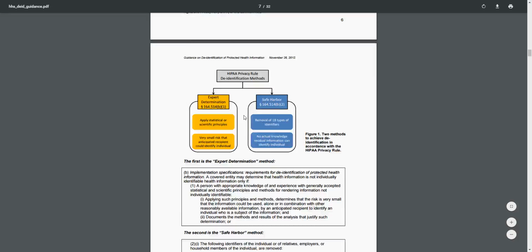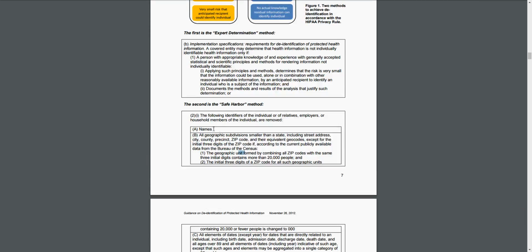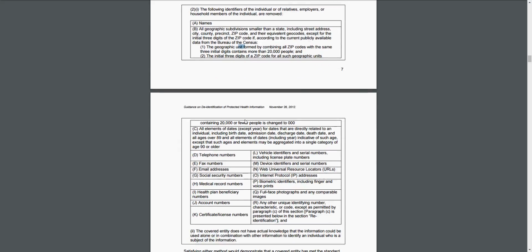And the way they have it defined here, you can look, is basically to remove anything that is related to the person. So obvious things like names, but also addresses, locations, age, especially if you're over the age of 89, then you're in a sensitive group. Telephone numbers, all this information can often be in DICOM data. Social security numbers, that will usually be in there as well, so you don't want to be sending that to someone if you want to send your DICOM data to someone.